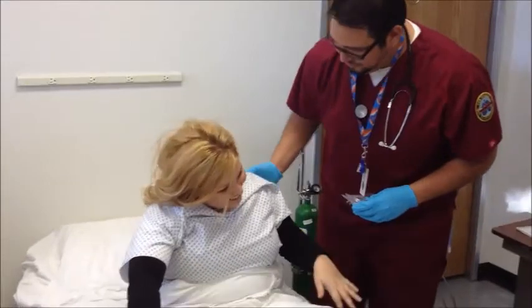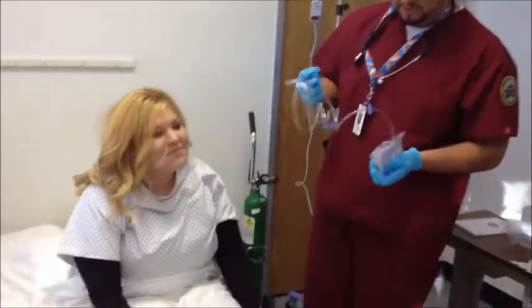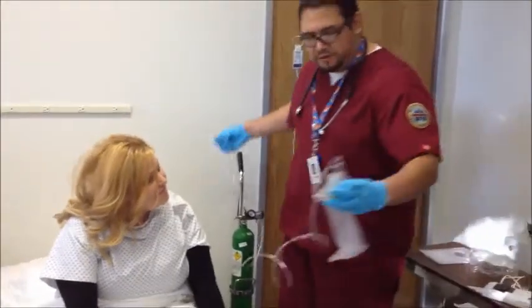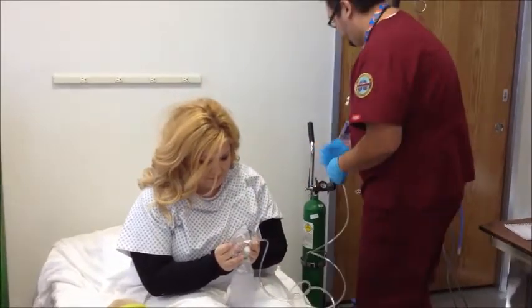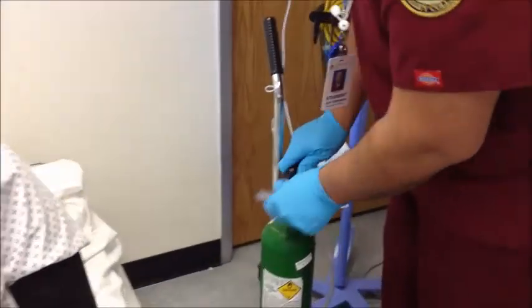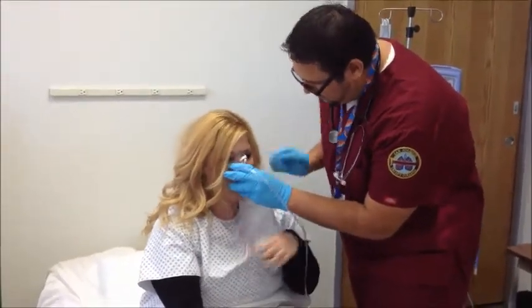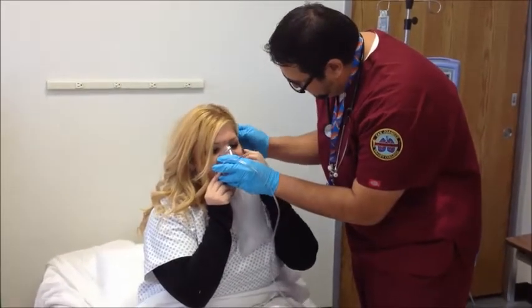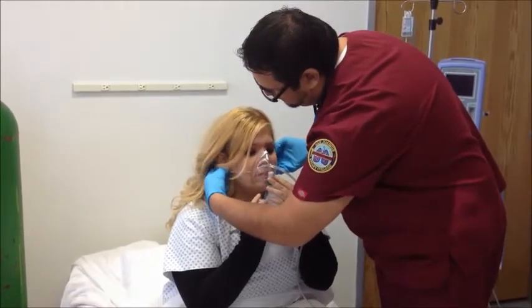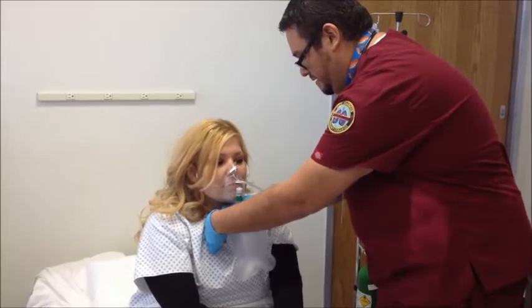Oh honey, I don't know if I can do that. No, we got you. I can't breathe. We got you. Go ahead and put this pillow right here behind you. I'm going to put this on your face real quick. Can you hold that for me right there? I'm going to put this behind here — behind the other ear. That's going to hold that mask in place for you. I want you to go ahead and breathe in that oxygen for me, okay? There we go.